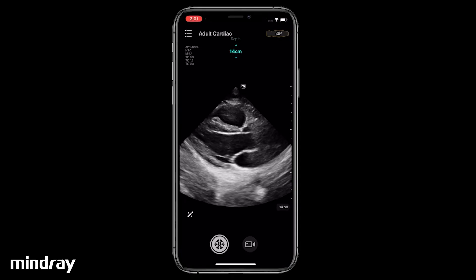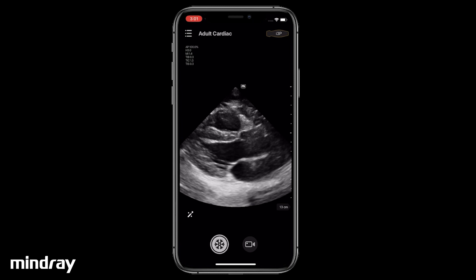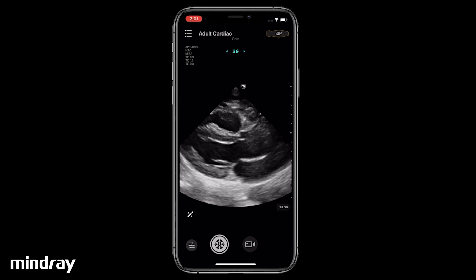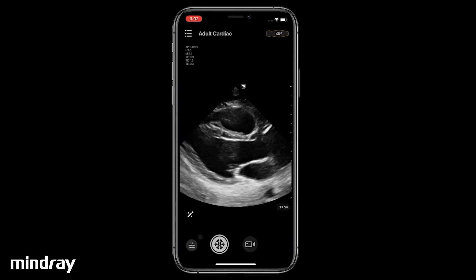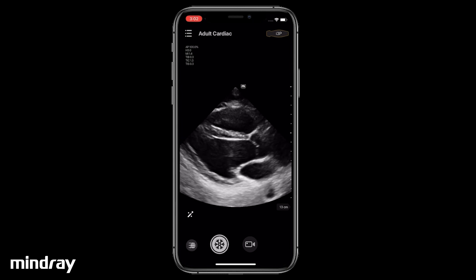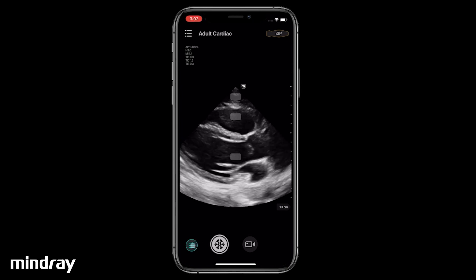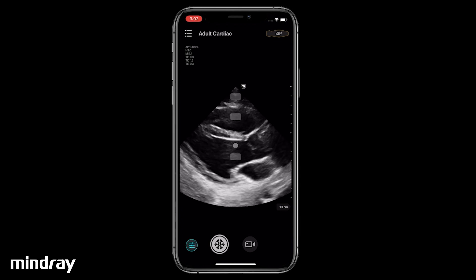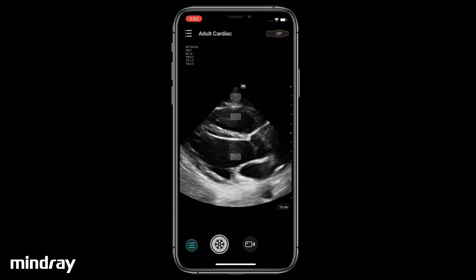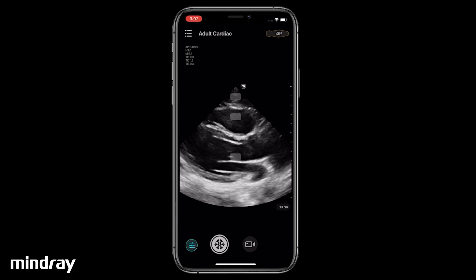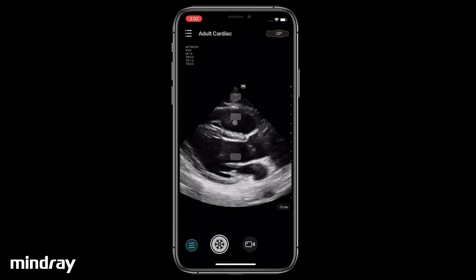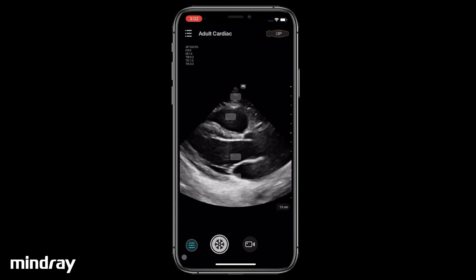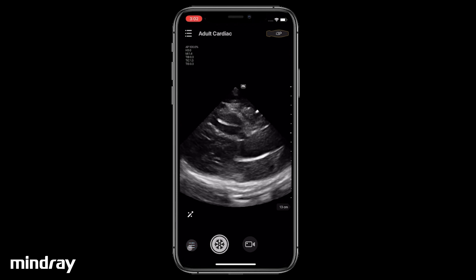Swipe up and down to change image depth. Swipe left and right to change image gain. When changing gain, the TGC icon appears — tap it to display the TGC sliders. Drag the sliders to optimize the gain at different depths.